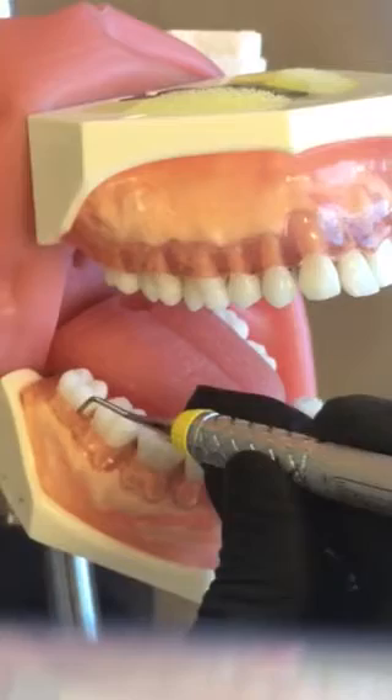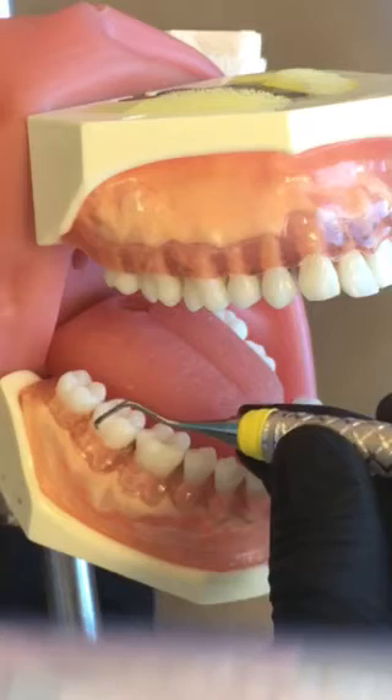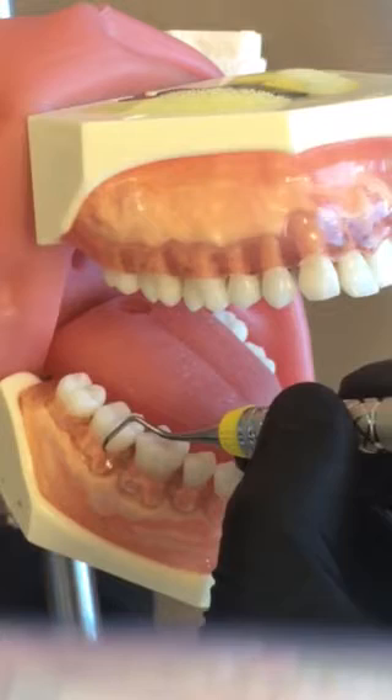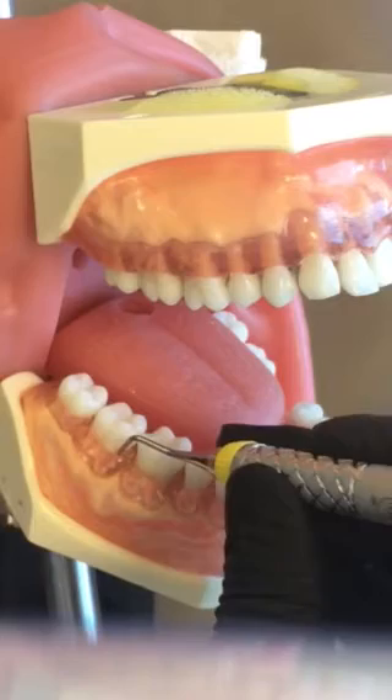With your curettes you're going all the way to the junctional epithelium, which is the base of the pocket. If you do feel calculus, make sure you get apical too, which means underneath the deposit. If you're not feeling any calculus then you're just going to be using a light exploratory stroke, but if you do come across a deposit and can get underneath it, you're really going to tighten up on your grasp just a little, be very firm on your fulcrum, and then apply lateral pressure to remove the deposit.